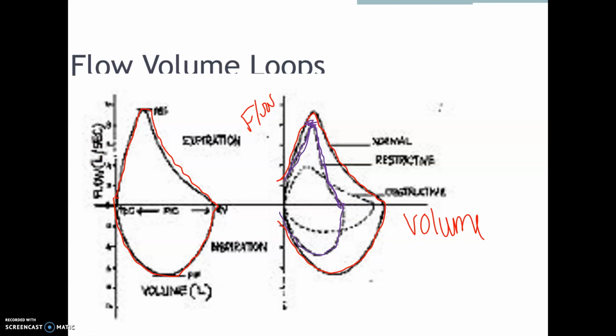And then if you look at the obstructive components, I'll make that blue. That's the third one here. Patient takes a deep breath in, blows, another deep breath in. That's obstructive. And obstructive diseases have problems with flow. So you'll see over here on the volume side, we reached a normal volume, but up here, we did not reach a normal flow level.